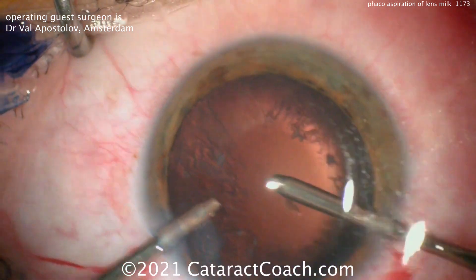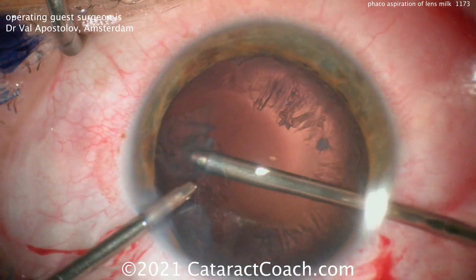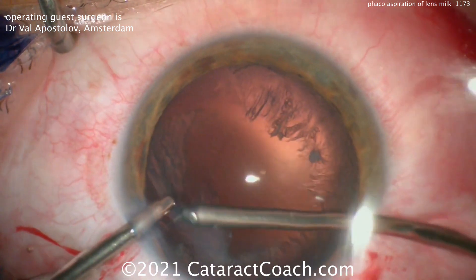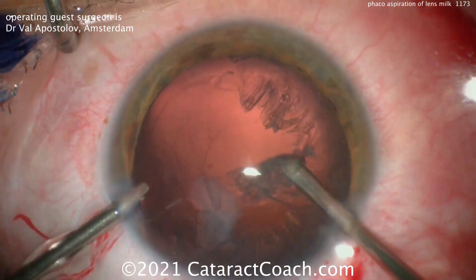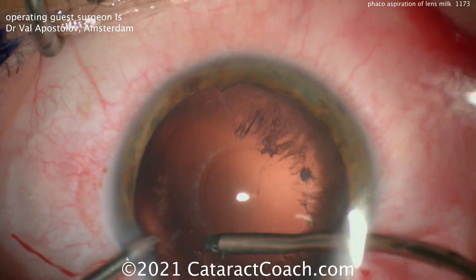Sometimes it can be more challenging to remove some of this cortex if you don't enlarge the rexis, because you're operating through that smaller opening. But with a bimanual system you can really get the capsular bag cleaned up nicely. There's a big advantage to using a bimanual irrigation-aspiration setup with a small rexis — much easier.